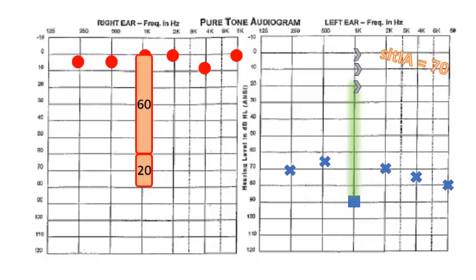Will it cause overmasking? No, because as the bone conduction value gets worse, it allows for more and more masking noise to cross over to the test ear side without causing overmasking. Even though poorer bone conduction results means less possible IA, it also means that masking noise crossing to the test ear will not cause overmasking. The lower the bone conduction threshold, the greater the SIT-IA value, and the less masking crossover. The poorer the bone conduction threshold, the less the SIT-IA, but more crossover of masking noise is acceptable.